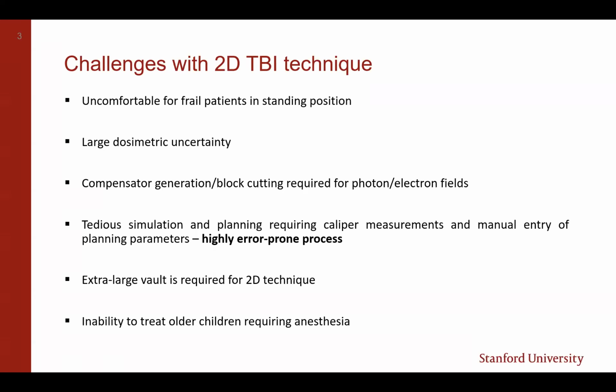There's relatively large dosimetric uncertainty in these techniques, mainly because of how we apply compensation to adjust for different contours in the patient's body, and also a lot of the time we correct for large discrepancies in heterogeneity within the patient, but not for more minor changes in heterogeneity.